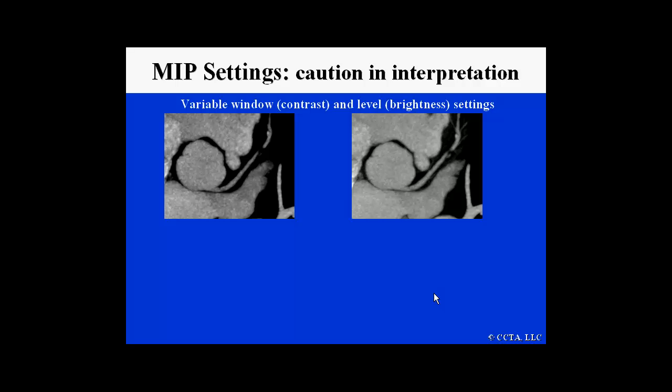Furthermore, in this gap between the proximal and mid LAD, I can now see a very faint lumen and an area of plaque that may well represent dissection. So my differences in the interpretation are from 100% occlusion on the left to a subtotal occlusion with possibly some ulcerated plaque within the same region.